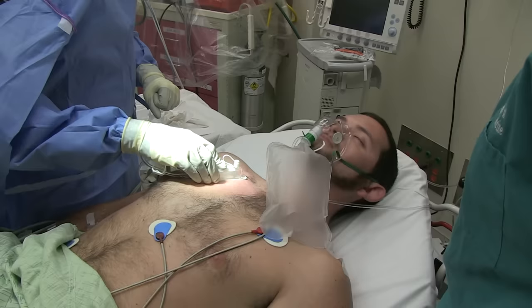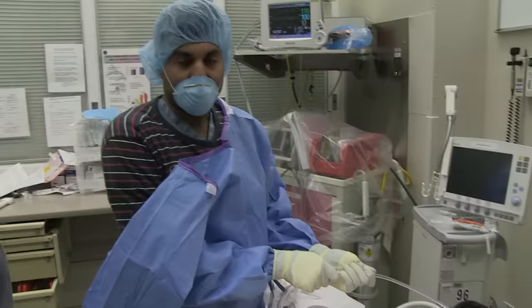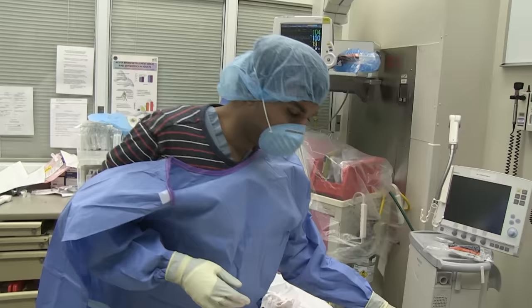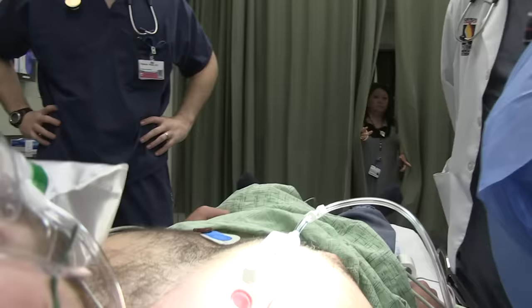And that's collapsed. And we're going to get a chest x-ray to compare in just a little bit, all right? So the next step is to get a confirmatory x-ray and then to repeat another x-ray in about 30 minutes' time. And then we continue to watch the patient for any complications. And you can actually see the fluttering of the little flutter valve here that will indicate that you're essentially in the thoracic cavity.